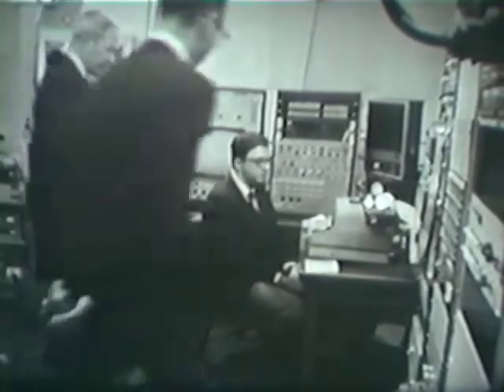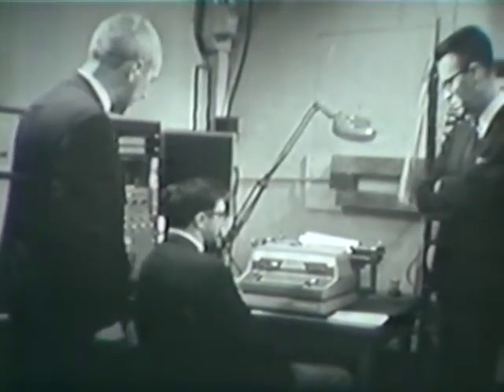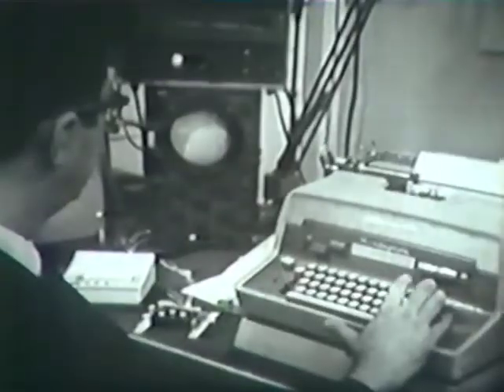Professor Donald Troxell, the other co-project engineer on this development, is here at the console, and he's going to do a little teaching and training of the machine for us. All right. I think what we'll do first is set up a word that the scanner's looking at, without any stored memory at all. Starting fresh, the machine now knows nothing, we'll start tracing letters and generating these code words that I mentioned. Right. And then we'll have to tell the machine what each word means, which letter it designates. So let's try the first one.